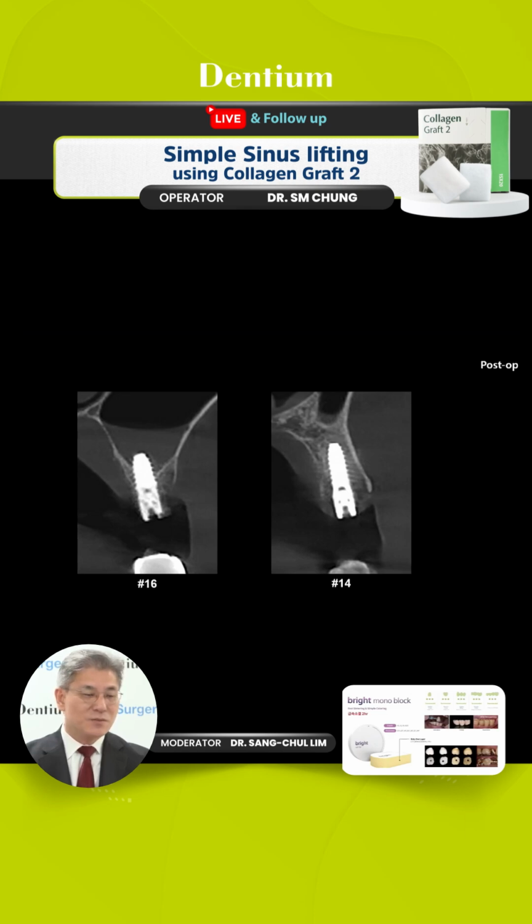According to this principle, the number 14 area is a very nice, well done installation. The implant fixture has a correct direction, engages the palatal cortical bone plate of the socket, and is filled with bone graft material with osteogenic collagen on the buccal side, between the buccal socket wall and the implant surface. Fortunately, this 14 area has an intact buccal bone wall.